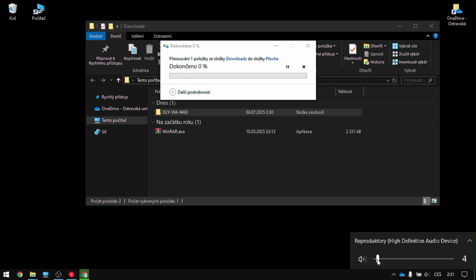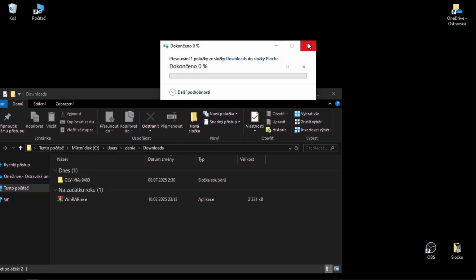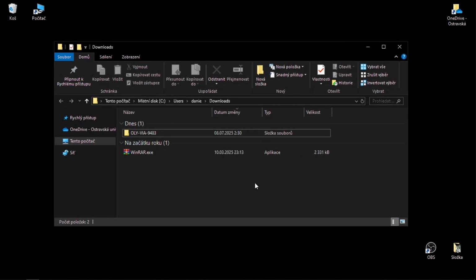I will also try to guide you through some mechanical and functional stuff about this app. I suppose I will just leave it here. And as you might have noticed, the original version is in Czech. This one is for the English-speaking students.